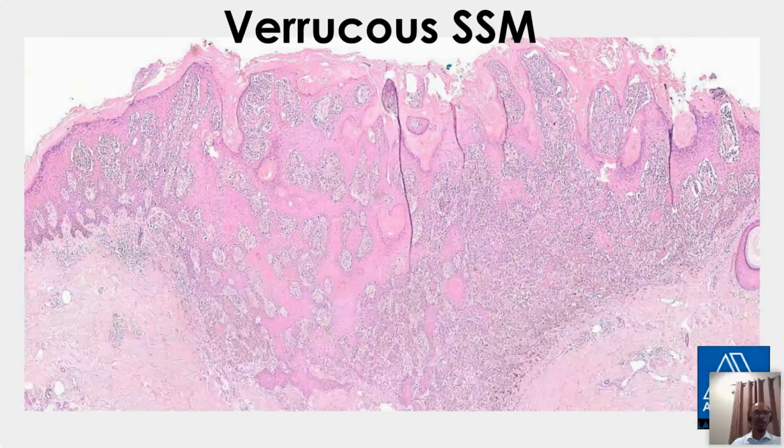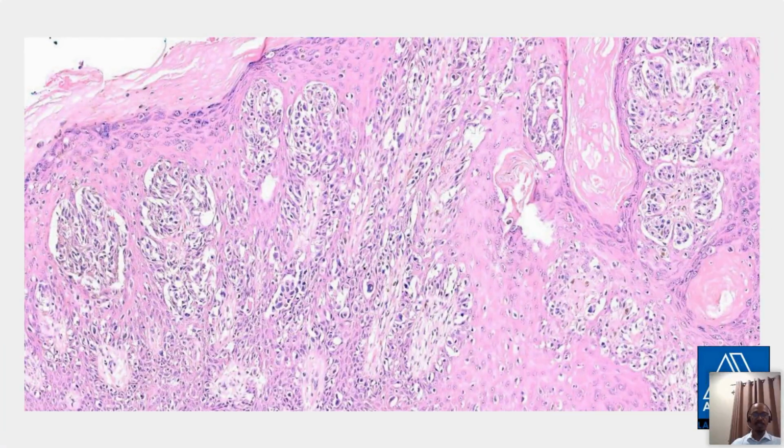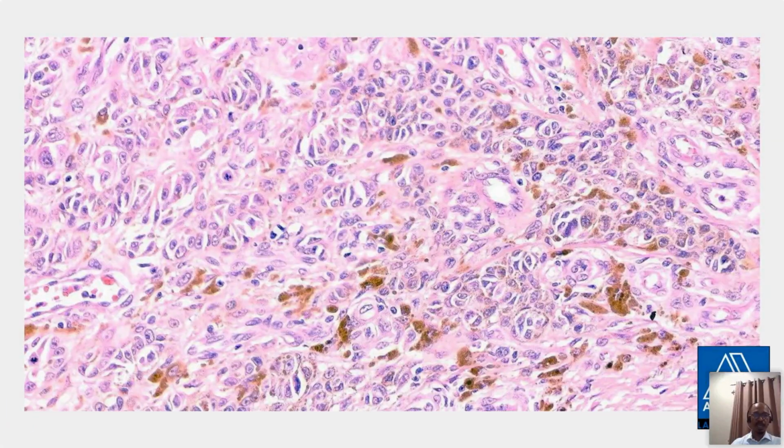And when we think of melanoma, most of us think of a big, ugly lesion histologically, like superficial spreading melanoma, an asymmetric lesion like this with asymmetric pigment distribution. And this particular variant is verrucous. At low power magnification, you often see irregularly distributed nests of atypical cells with a lot of pagetoid scatter and dermal invasion by atypical melanocytes, and there's a mitosis there.